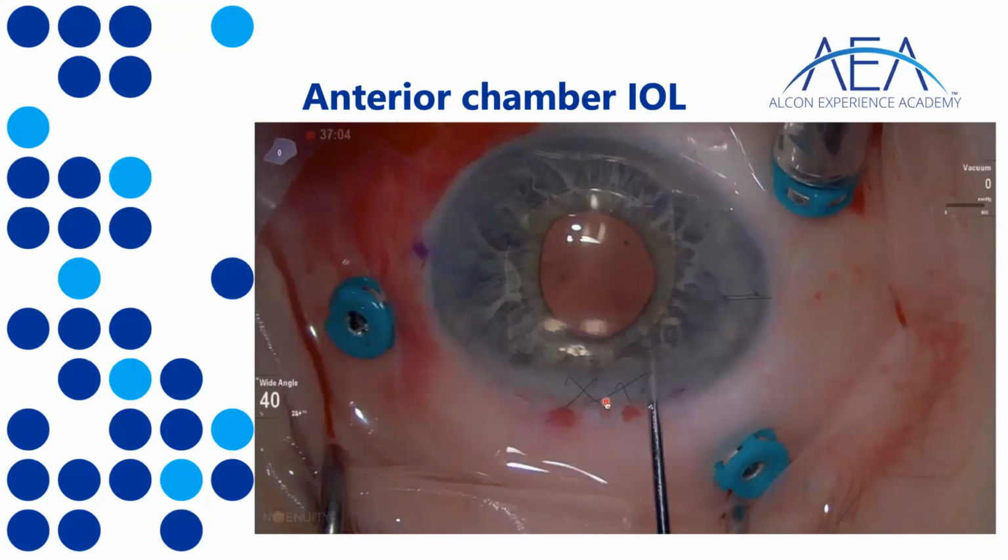You can easily slide the lens through this frown that you have created, and most of the time this is absolutely sutureless. So first of all, it doesn't create any astigmatism, and most of the time you really don't have to suture the sclera, but you simply put the conjunctiva on top of it, and that's more than enough to be watertight.